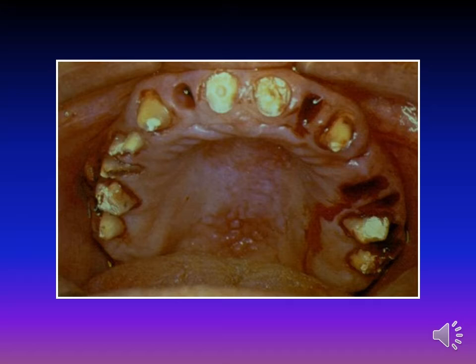After a suitable interval, when wound healing is complete, the teeth are given their final contouring, copings fabricated if indicated, and the appliance either refitted or remade. The various techniques for preparation of the abutment. Number one, simple tooth modification and reduction.